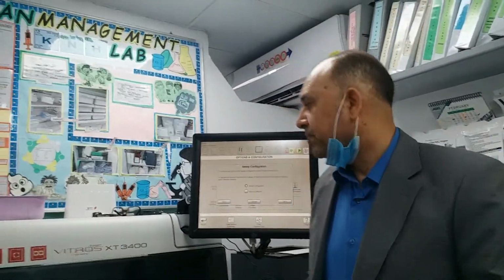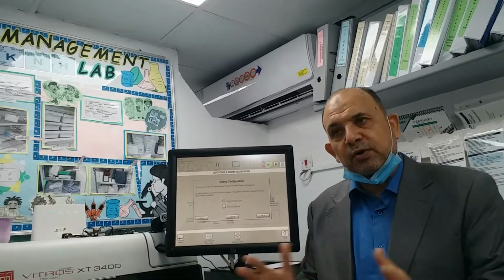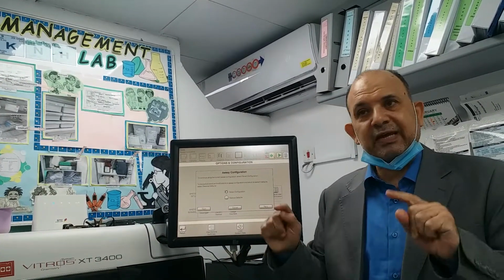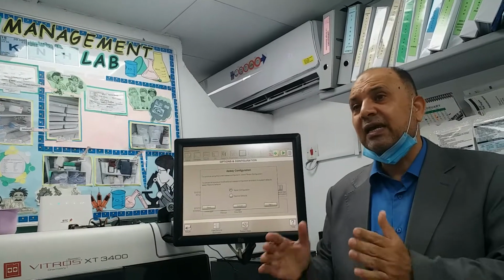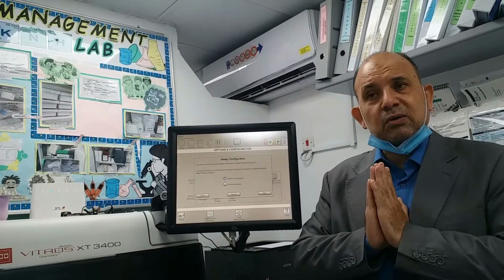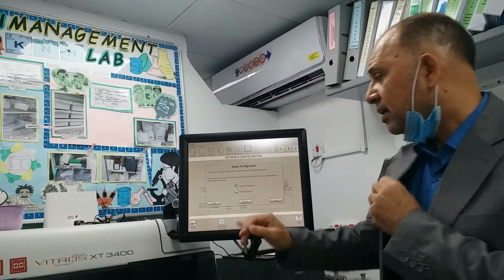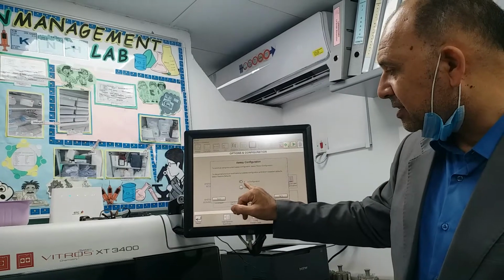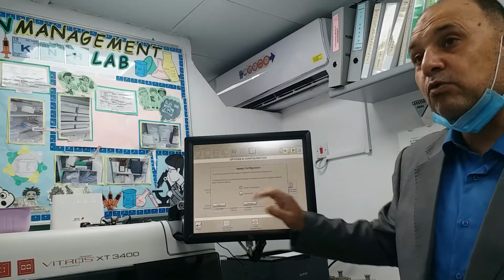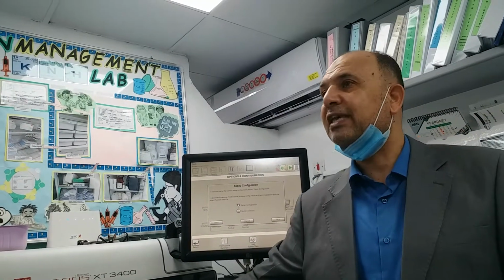Okay? So this is a very important point: to open your AMR in case you have a reading of some analyte less or more than your AMR, or the reportable range of your machine. Okay? So that one, what we call it, the retain configuration.